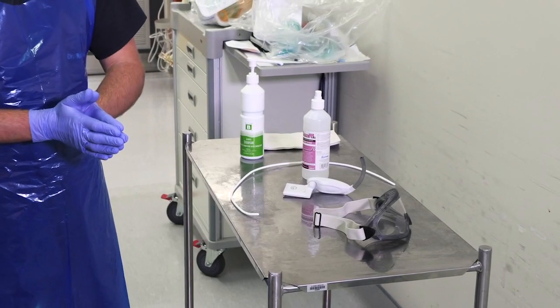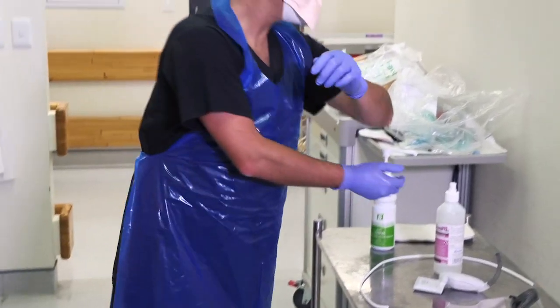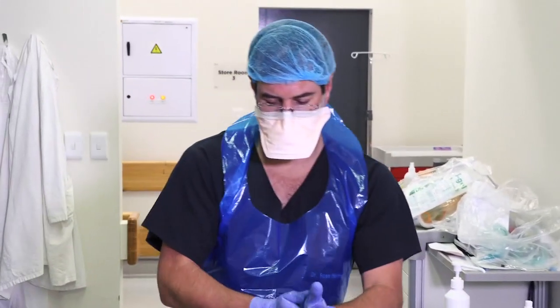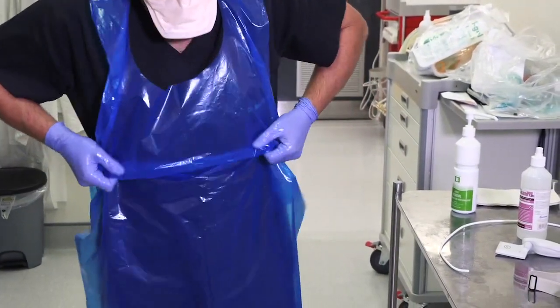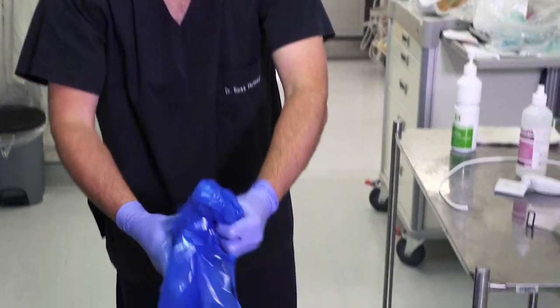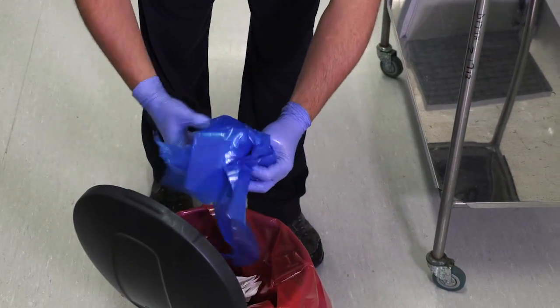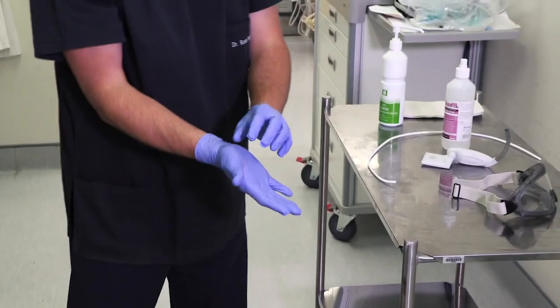When that's complete, you're going to remove your gloves and apron — pulling away from yourself so it doesn't touch your body. Carefully scrumple it up so that it doesn't hang over the sides of the dustbin. Put your gloves into the red bin.